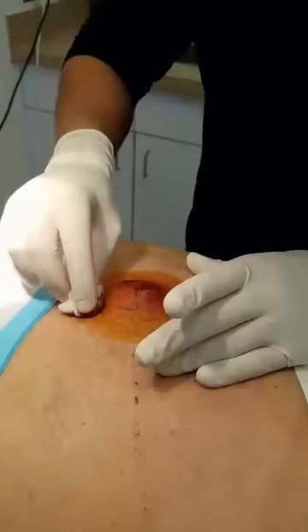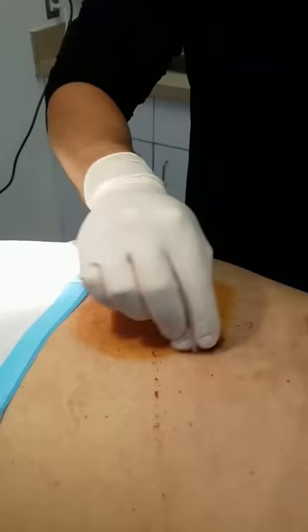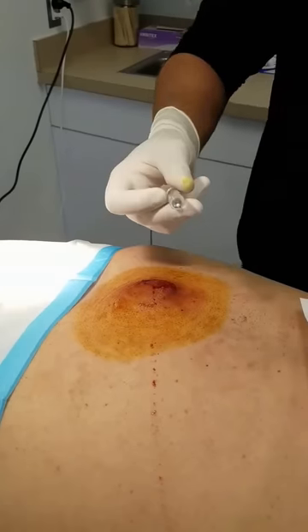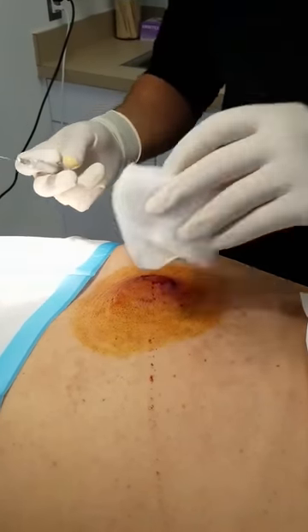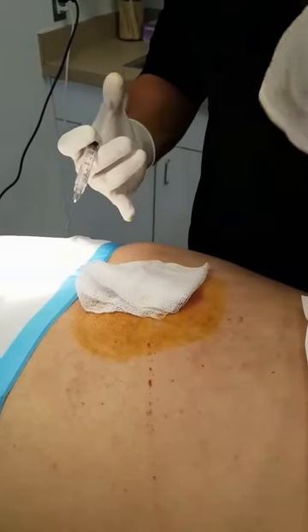So let's get started. Go in a circular motion. Then you grab the lidocaine with epi. What I normally like to do is put a little bit of gauze over it so that way when we're injecting it doesn't pop back over on you.